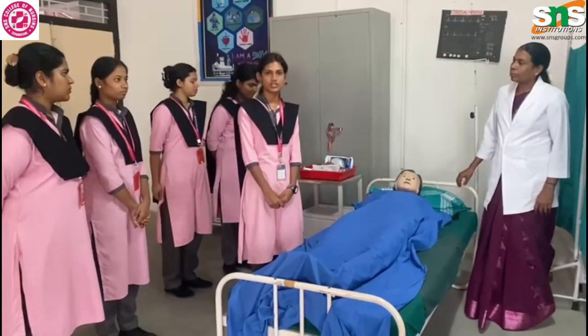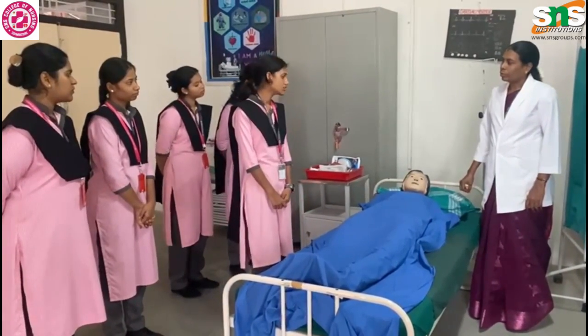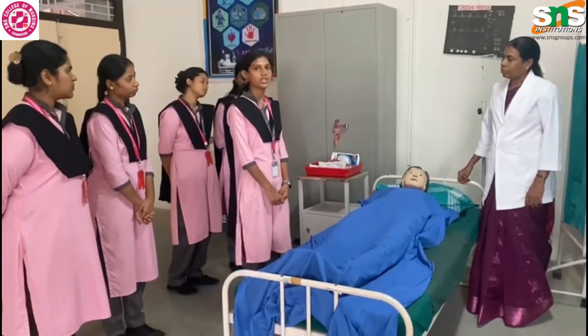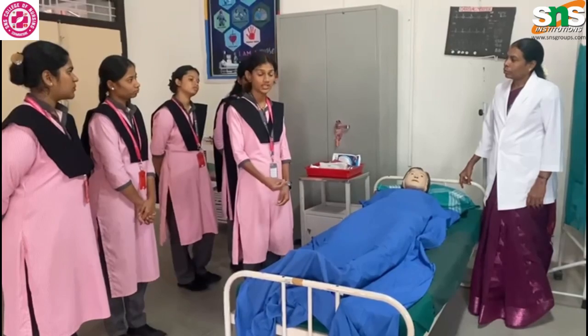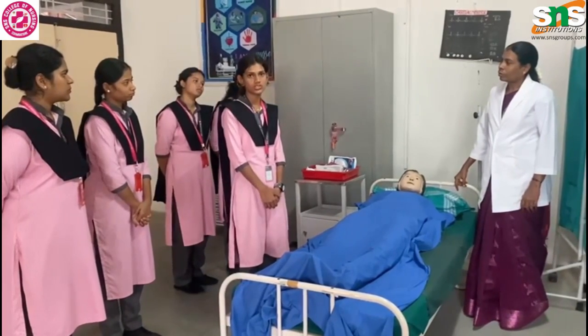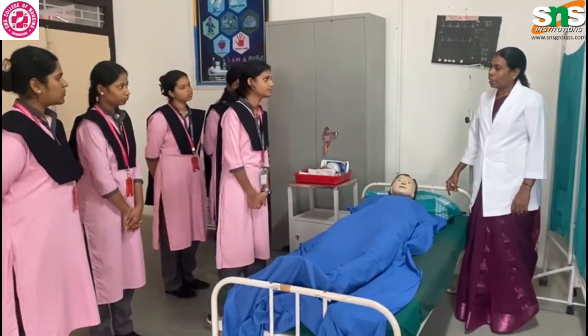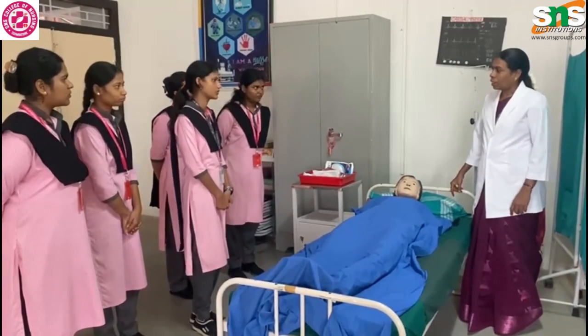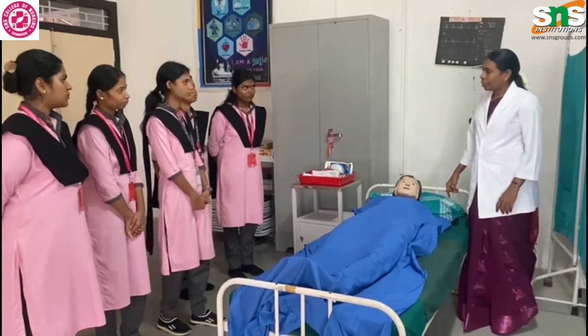Hello everyone, myself Sona. I'm from SNS College of Nursing. I'm here to tell about the indication of nasogastric tube. Indication for NG tube is the patient who cannot eat, and the patient who refuses to eat, and the patient who cannot maintain adequate oral nutrition, and patient on surgery, especially on GI tract. Yeah, especially oral surgery. They are not able to chew orally. In that case, we can do NG tube feeding.